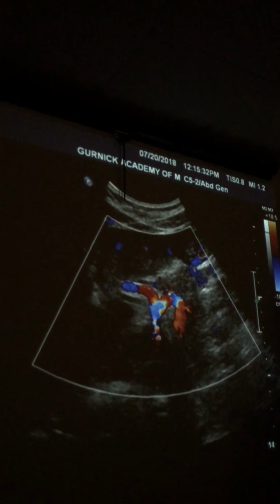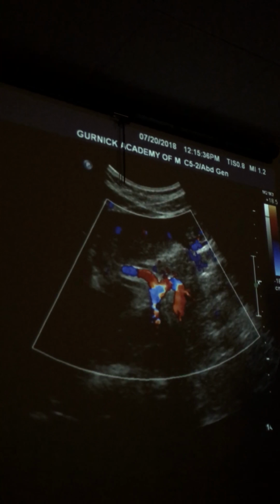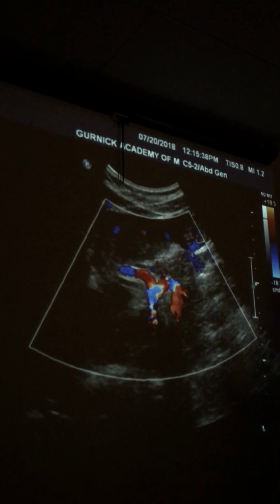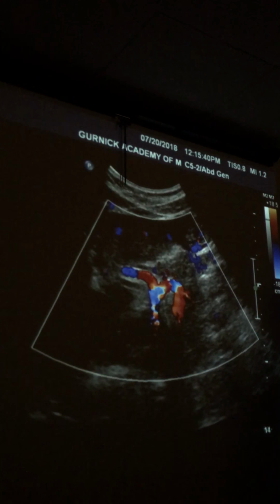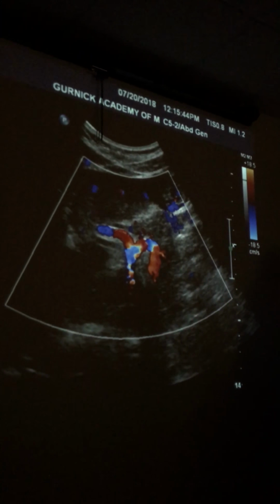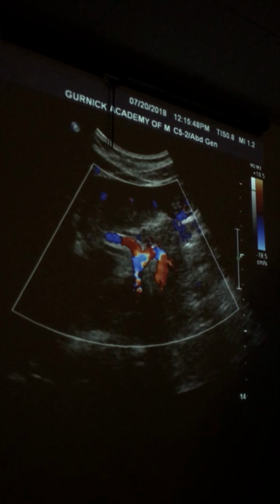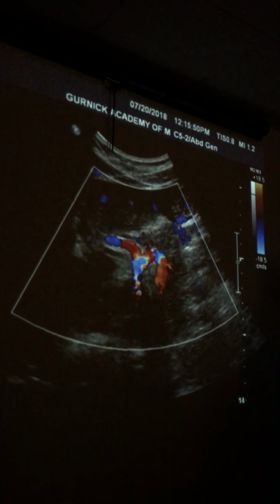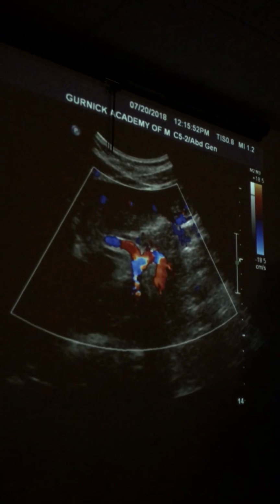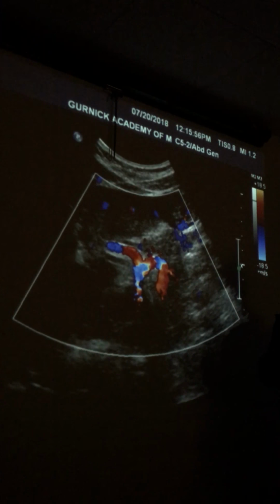Sometimes the over scoop might be better. Sometimes the left scoop might be better. For some of you, the over scoop is better. Yeah. Try both. Yeah, I agree with Steph. A lot of you guys, I find the pancreas and all these landmarks better if I put my probe this way and sweep through the left lobe this way instead of being right on it or instead of being under it this way. Because what is this doing? This is using that left liver tip as a window to see. Not everybody has a big left liver tip. This isn't going to work for everybody, but definitely try.